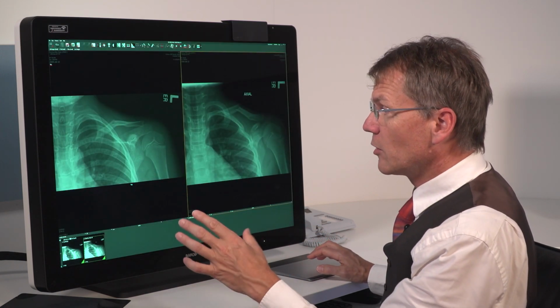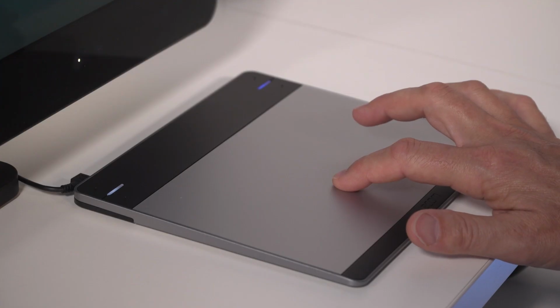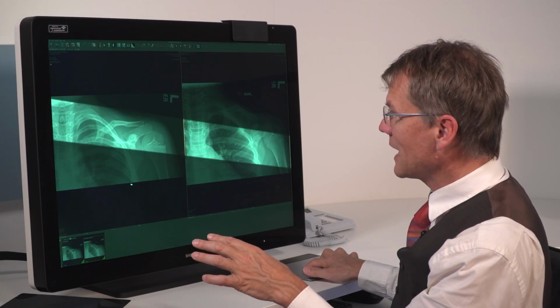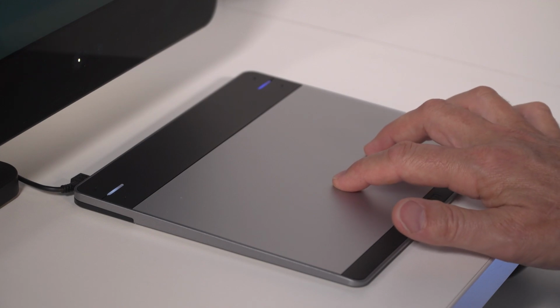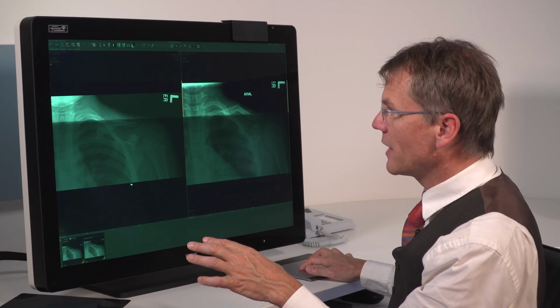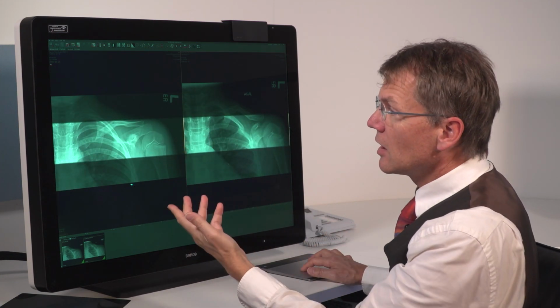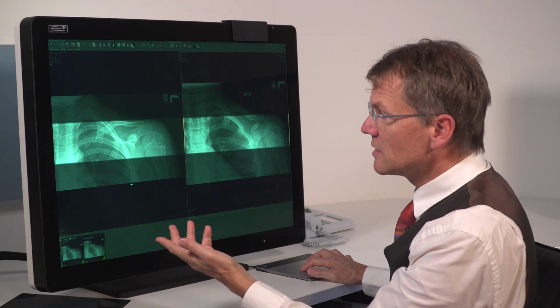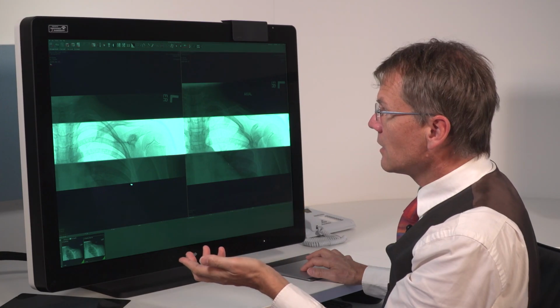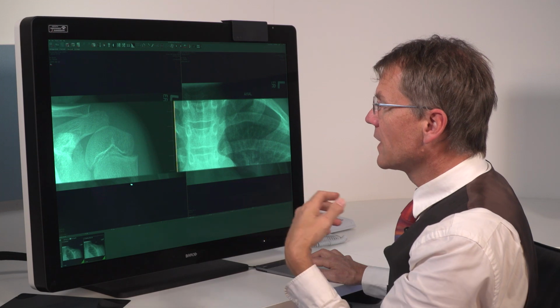To go into the spot view align, you enable the spot view with the one finger, touch and hold down a second finger, and the angle of your two fingers set the angle of the bar. So with that, you can then lift up your second finger and you can use the one finger to move that bar back and forth to compare things across multiple images. You can double tap once you're in the spot view align, and you'll get the invert.